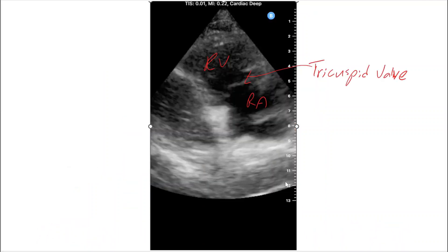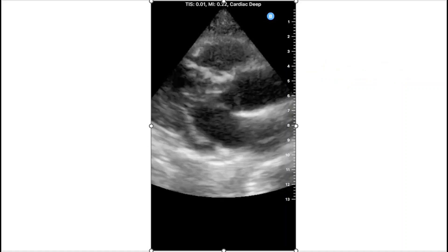This is the RV inflow view — this is the RV, this is the RA, and these are the tricuspid valves. This is the parasternal long axis, and as you tilt the transducer towards the patient's hip, you get the RV inflow view as shown in this video.